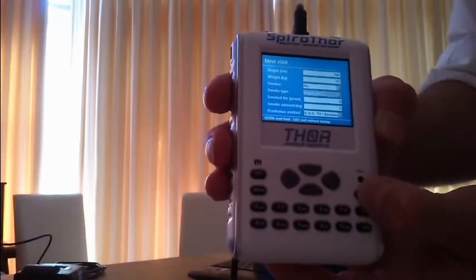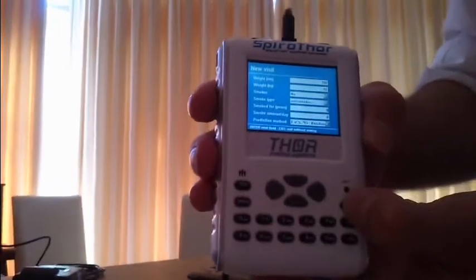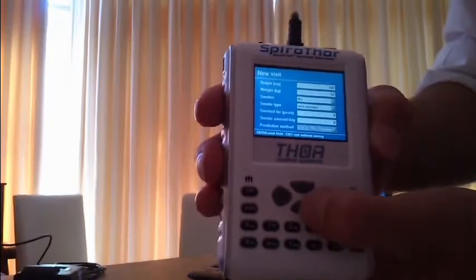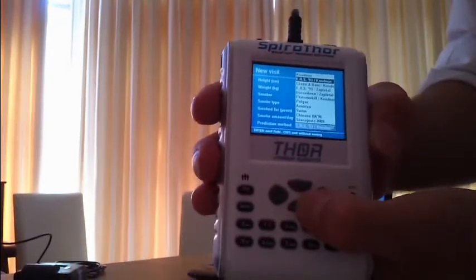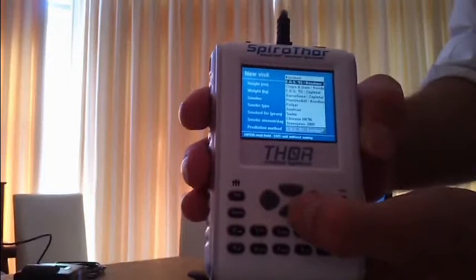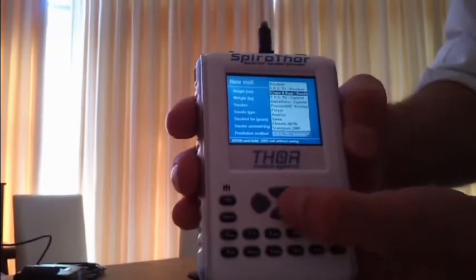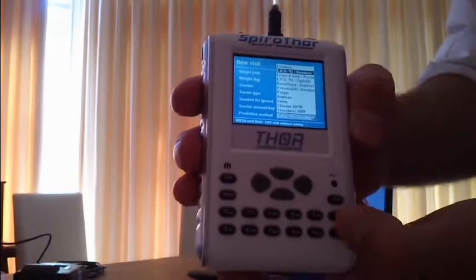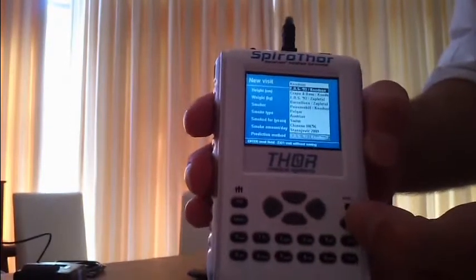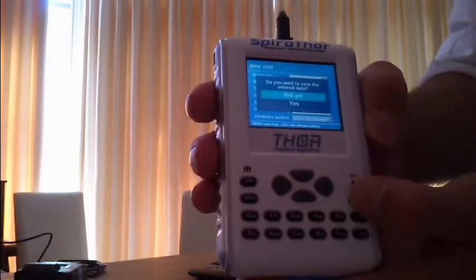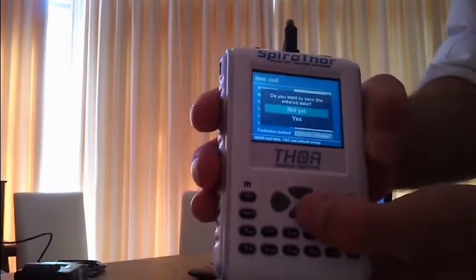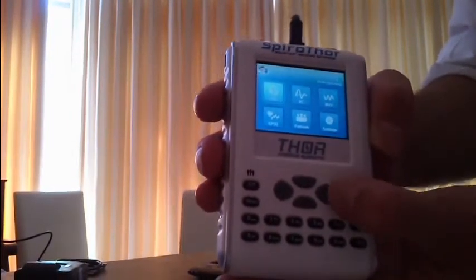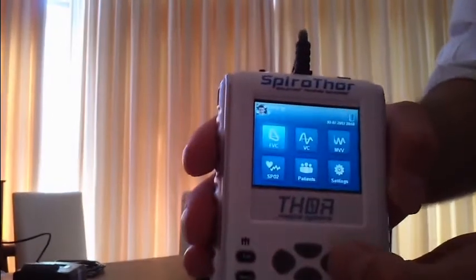The predicted algorithm can be selected by hitting the down button. We can for example select the ERS 93, which is most commonly used in Caucasian population. Then it asks do you want to save the data, and you go down and say yes. Here we are at the main menu.